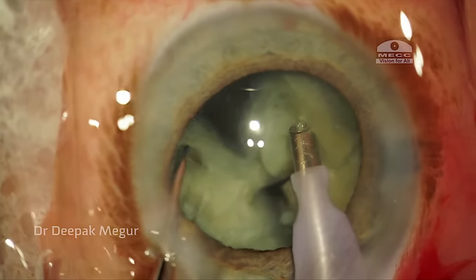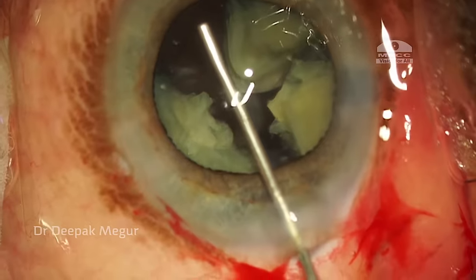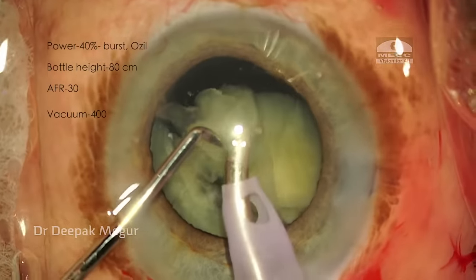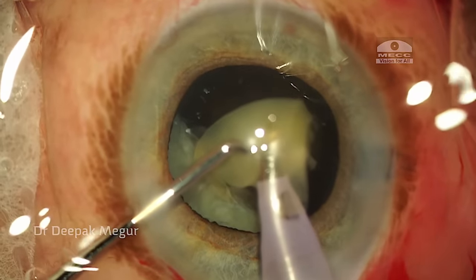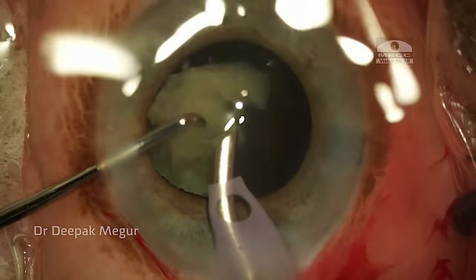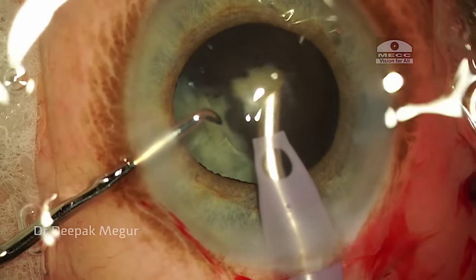I grip the nucleus and try to separate using my left hand — a little patience is a great thing to have in such situations. I go back to fill the anterior chamber and capsular bag with dispersive OVD, then move on to emulsifying the fragments. The trick here is to be as slow as possible — something like slow-motion phaco, with very low parameters, to ensure no turbulence and no fluctuations in the anterior chamber, as I am working more anteriorly because I am worried about the flimsy bag. The phaco power is set so the fragment never leaves the tip; it stays close and is slowly emulsified, preventing chattering and the nucleus flying around.